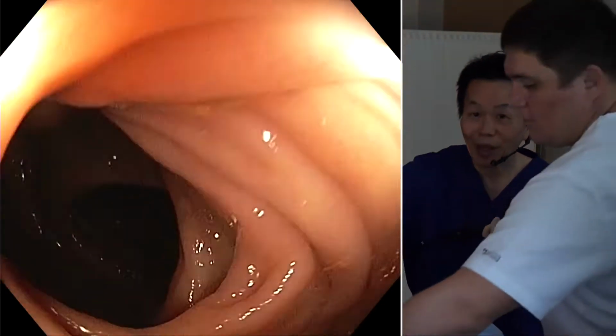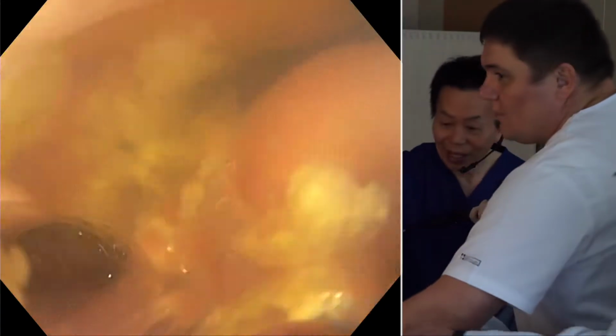But it's a little bit complicated. Sorry. So be careful. No. Right decubitus will be better. Right side, on the right side. Yes, but be careful. No. Change the position. Before that, wait a minute. Before that, you should move the legs.